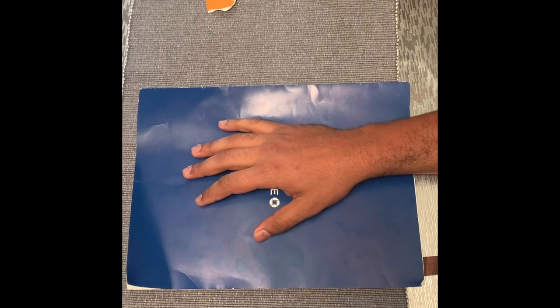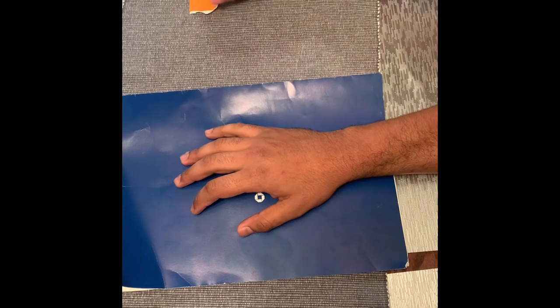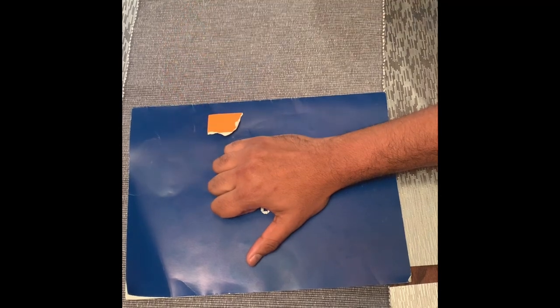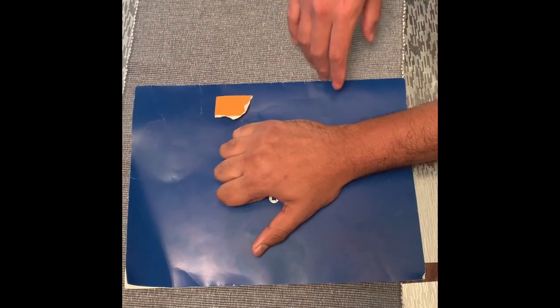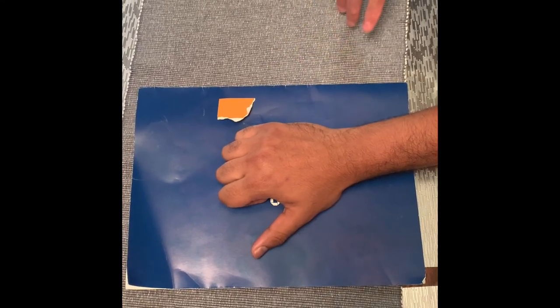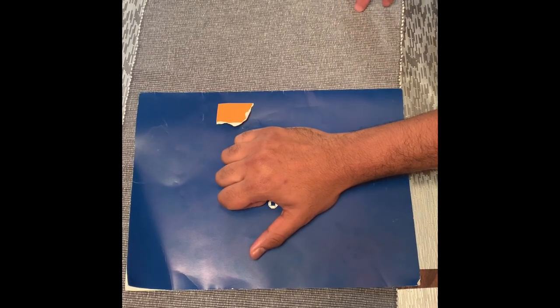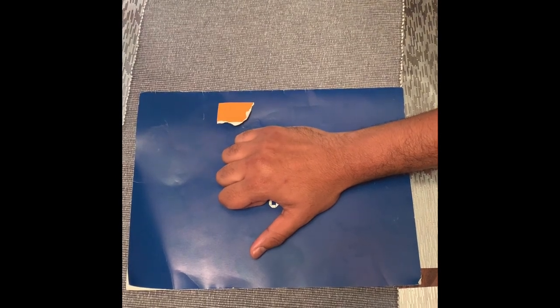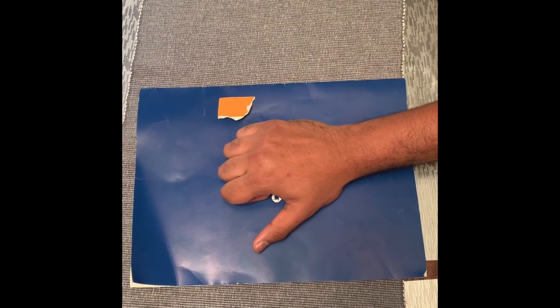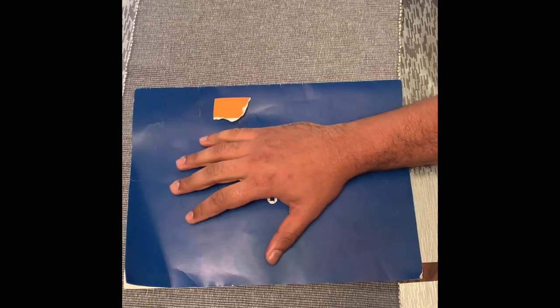Now we're going to see the three views of the wrist. We're going to start with the PA wrist. Place your hand and make a fist like this — perfect. I'm going to place the marker. The central ray is going to be directed perpendicular to the mid-carpal area. The anatomy demonstrated is going to be the PA projection of the carpals, distal ends of the radius and ulna, and the proximal end of the metacarpals. Don't move — click — perfect, relax.